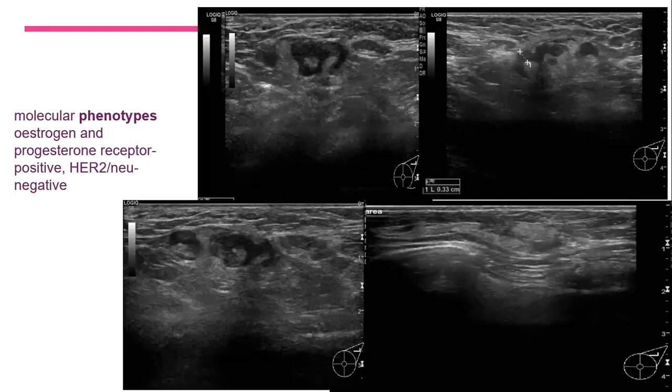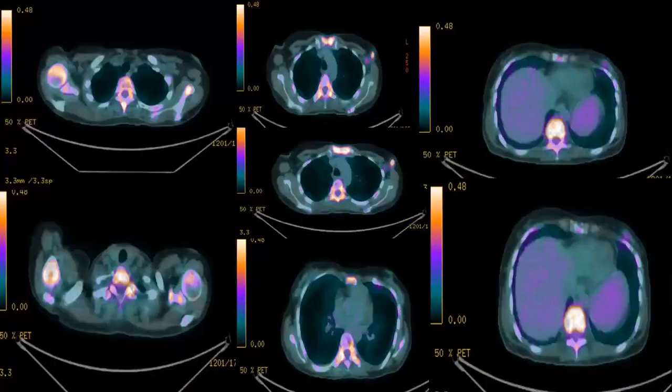And then after that, three or four times the radiologists tried searching for the breast lesions on ultrasound, but they could not appreciate it. Okay? And based on this result, they sent the patient for a PET scan.